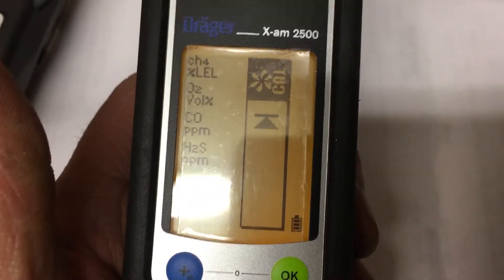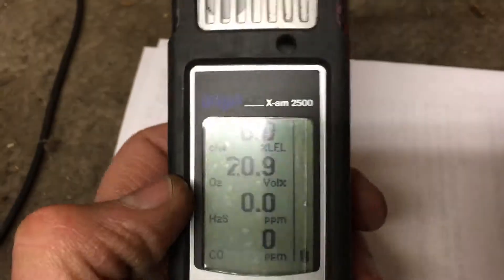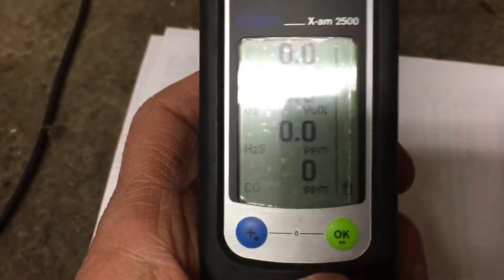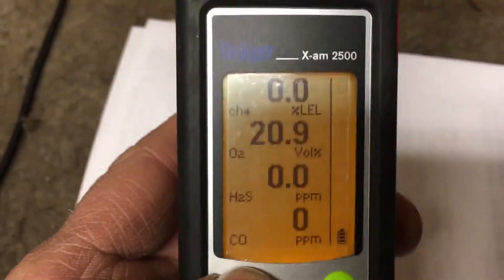This device is still warming up with two minutes to go, so I'm switching to one that's already been on for a while and is warmed up. I'll go ahead and do the fresh air cal on that one, pushing the blue button three times.